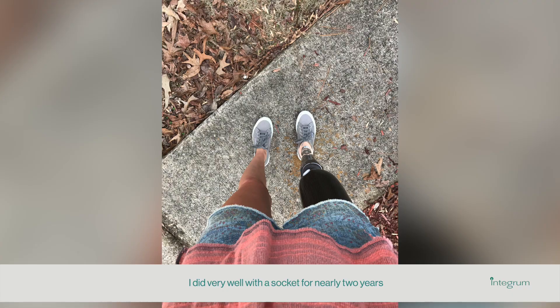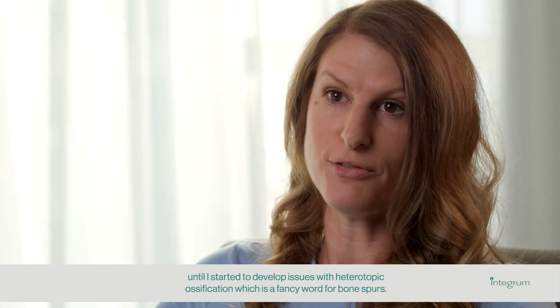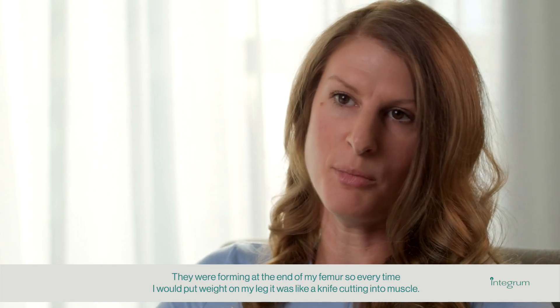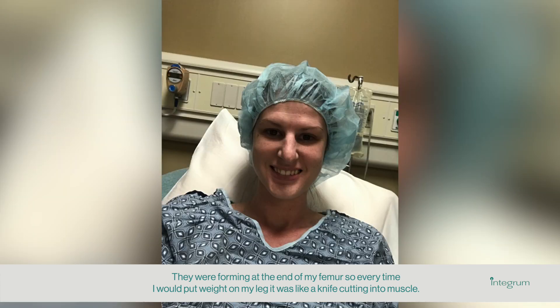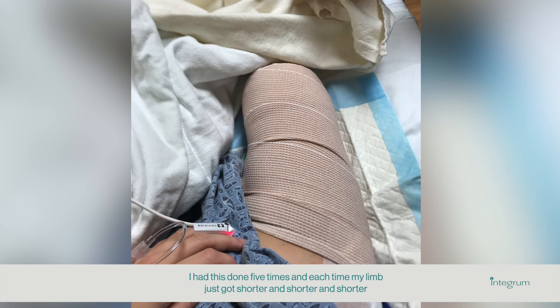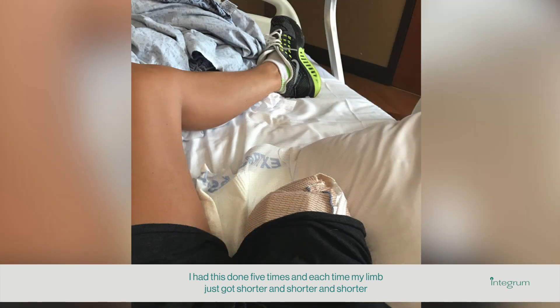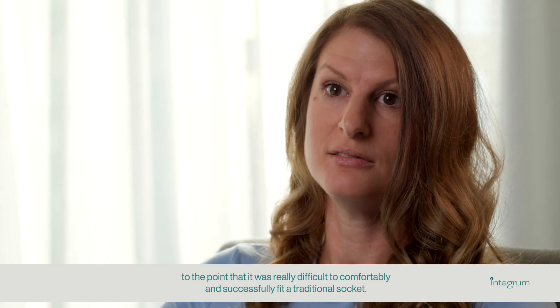I did very well with a socket for nearly two years until I started to develop issues with heterotopic ossification, which is a fancy word for bone spurs. They were forming at the end of my femur, so every time I would put weight on my leg, it was like a knife cutting into muscle. I had a revision to have that cleaned up, and it happened again within three months — five times total — and each time my limb just got shorter and shorter to the point that it was really difficult to comfortably fit a traditional socket.